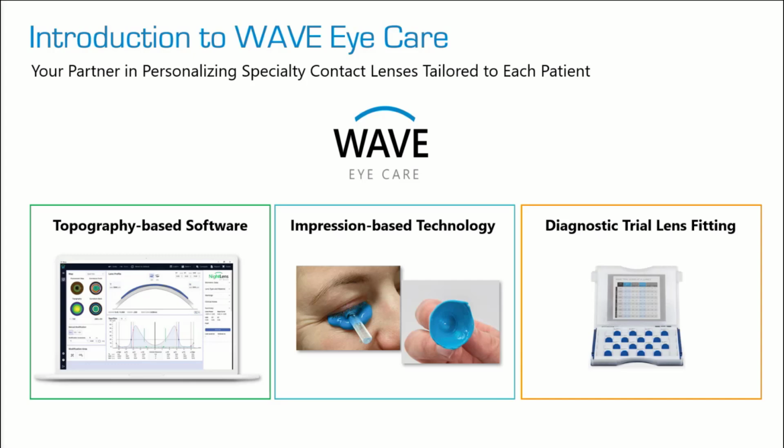Wave Eye Care is really focused on making specialty contact lenses feel truly customized for every patient. And whether you're just getting started in specialty lenses, beginning to explore topography-driven designs like we'll be talking about today, or beginning to manage more complex cases and wanting to use impression-based technology, Wave gives you the tools, the technology, and the support that you need to fit with confidence at every stage of your specialty lens journey.